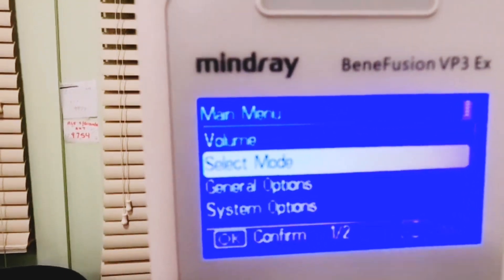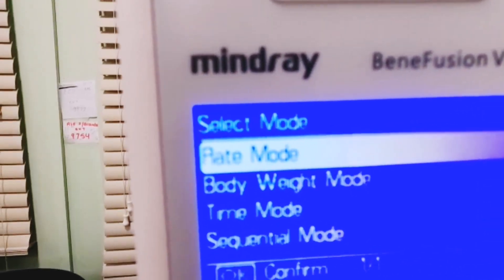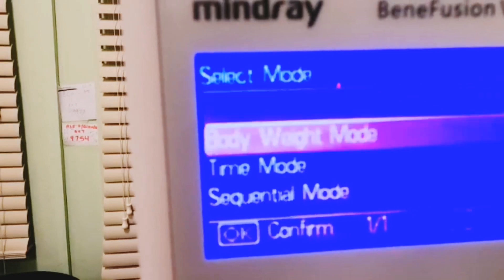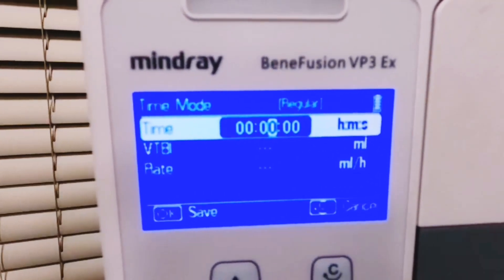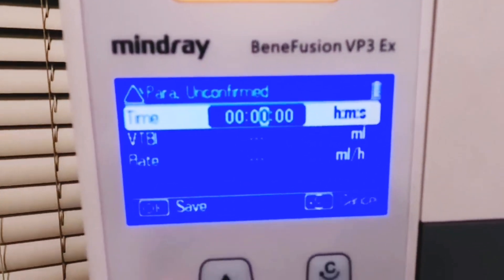From the main menu, we're going to select mode — press OK on select mode. For IV fluid infusion, we're going to select time mode and press OK.